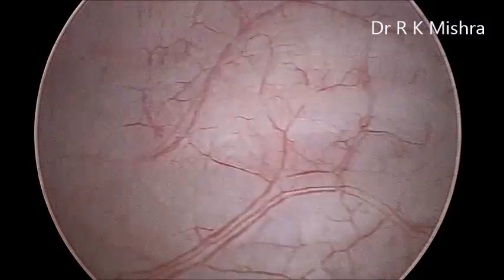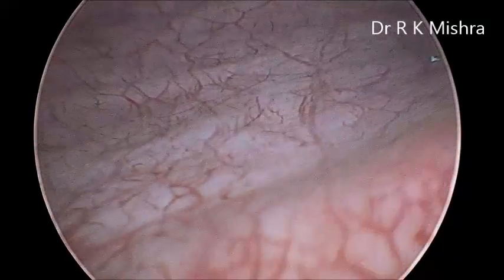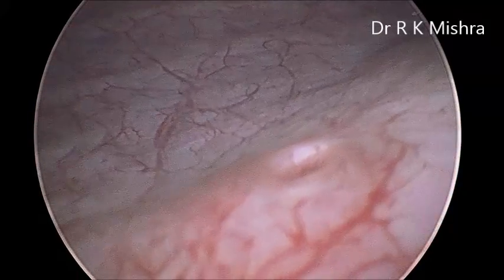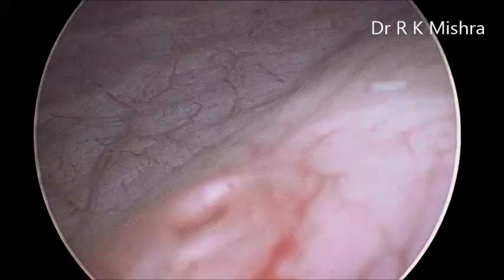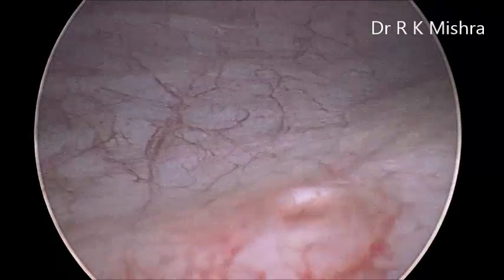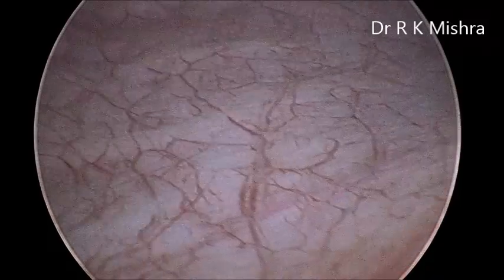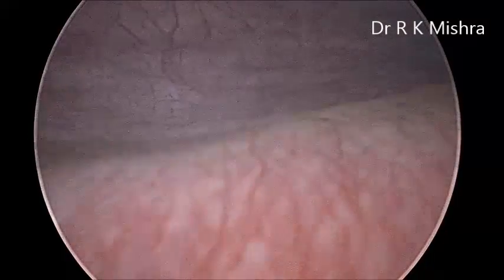Here is the front wall — the fundus. This is the left wall, and this is the ureteral opening of the left side. This is a normal diagnostic cystoscopy.